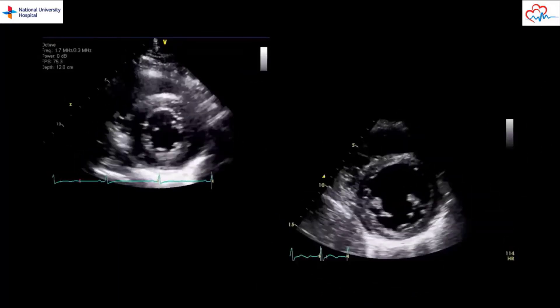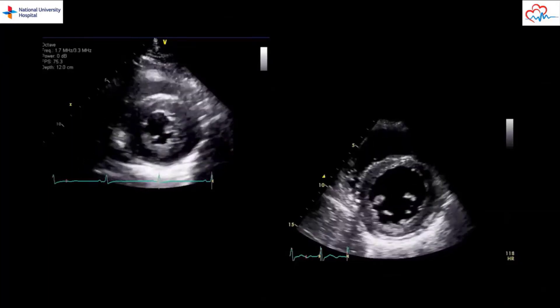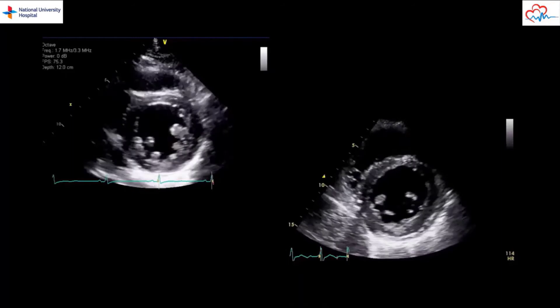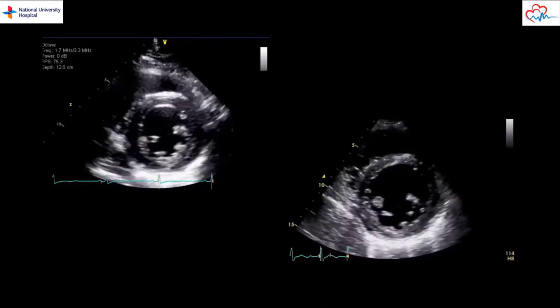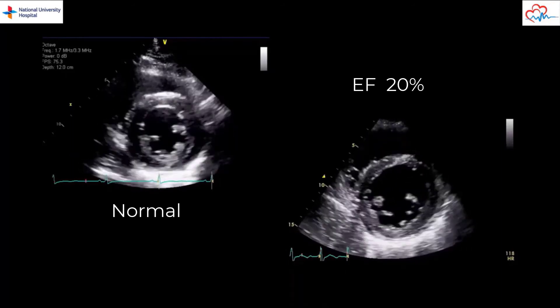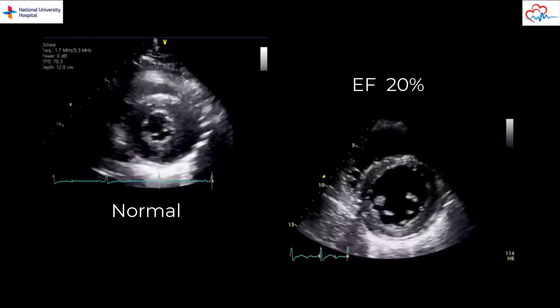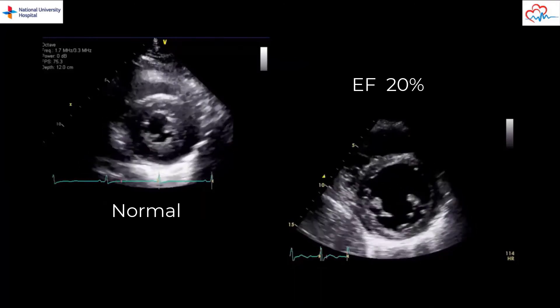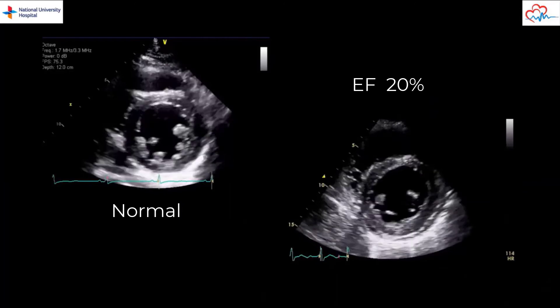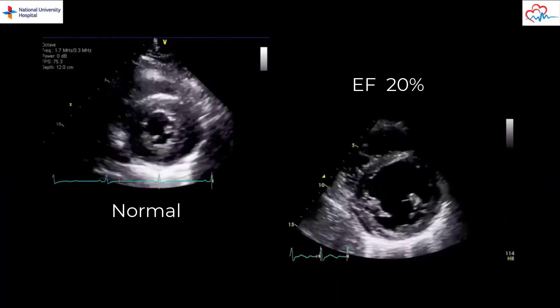Next we can compare an LV with normal EF, echo clip on the left, with an LV with severe systolic dysfunction. The echo clip on the right shows a poorly contracting LV. EF is estimated at less than 20%. These are all views of the mid-LV cavity short axis. The mid-portion of the LV is recognized by the presence of papillary muscles.